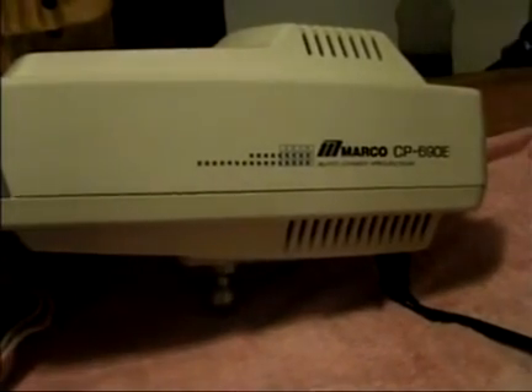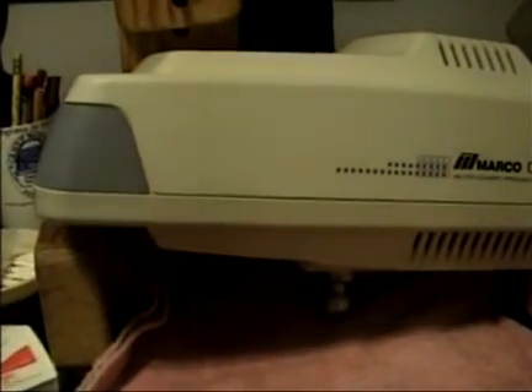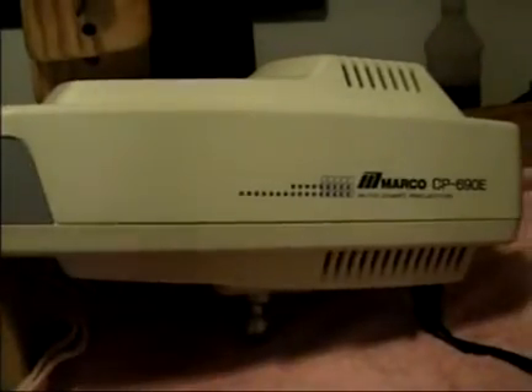In the prior week there were some malfunctions — it was masking the chart when it was supposed to be open, and it was just acting improperly. Then a few days later it didn't work at all.